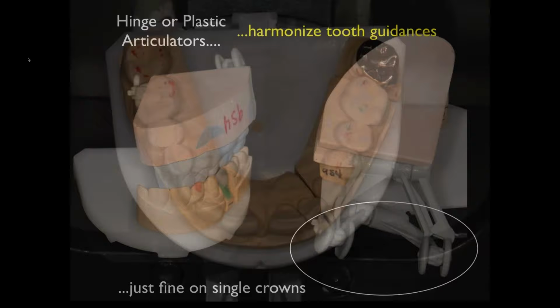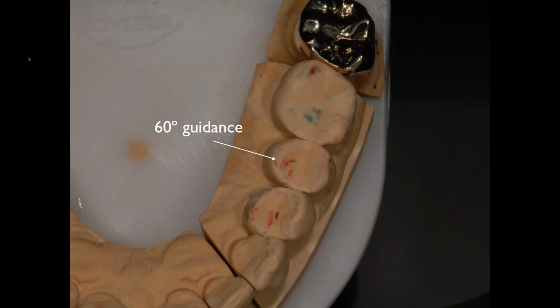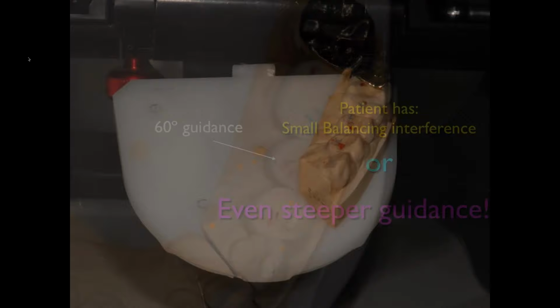And here's a case that I just use as an example of all this, where at 25 degrees, we saw some balancing interferences here, okay. At 60 degrees, they were gone on the first bite, but still a little something on the second bite. So the patient either has a small balancing interference in group function, or they're even higher than 60 degrees, which is not that uncommon, okay. But articulators don't do it, and we never go higher than that. So we're going to assume that.